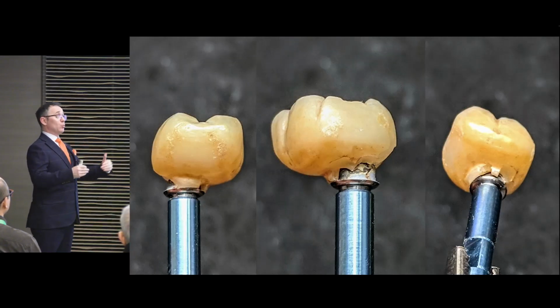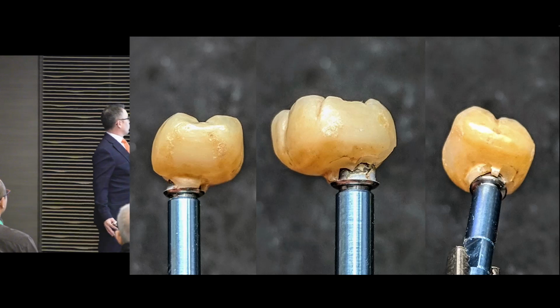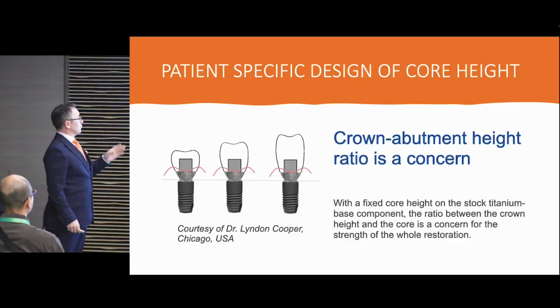We do a lot of rework for other labs. Now, when I look at this failure, this isn't really saying that tie bases are good or bad. There's some very switched on people, and I saw the smiles. We know why that failed. That is all failing due to cantilever loading. There's a lot of issues happening around that.